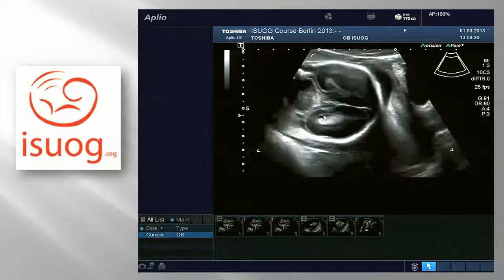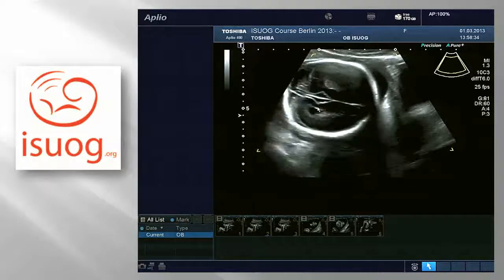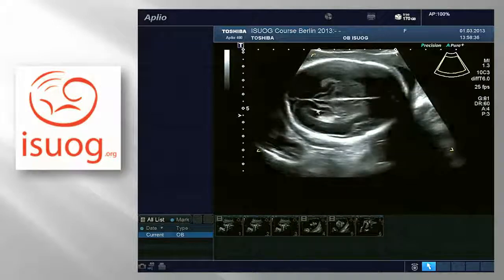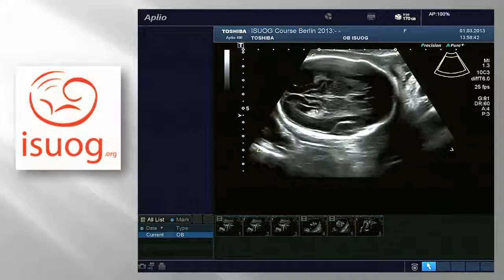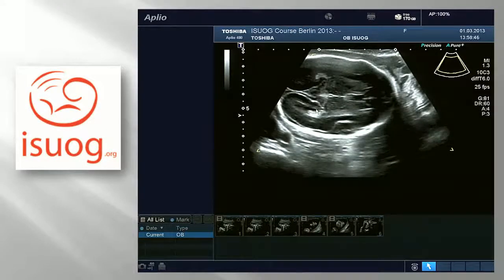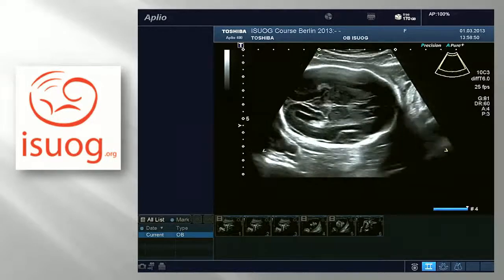And if we rotate a little bit, we can also see the calcarine fissure right there. See it? If you, as Laurent Guibault suggests, want to standardize the measurement of the lateral ventricles, that is a good landmark.